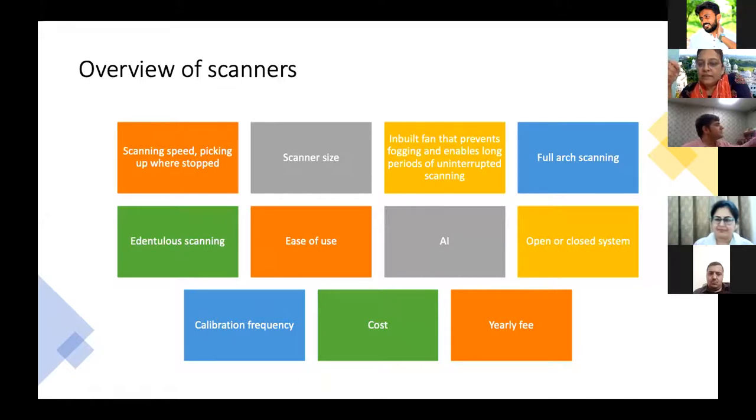As Dr. Swati discussed yesterday, the scan has to have its initial point of scanning. Every time the red ball comes, it has to go a step back, locate the initial position, and then start scanning again. So whenever there is a defect in the palate, the continuity is broken and you need to realign to get the initial point and then scan. As a result, the entire palate doesn't scan in a single go.